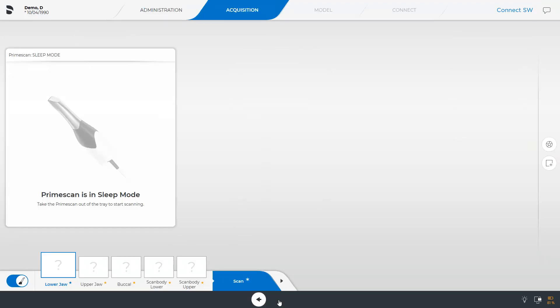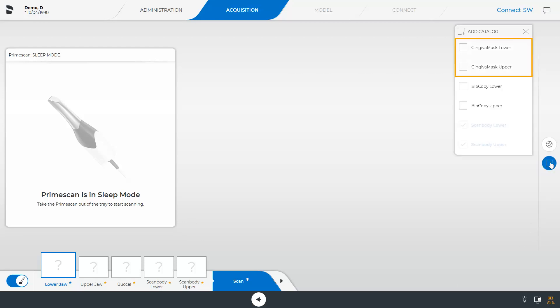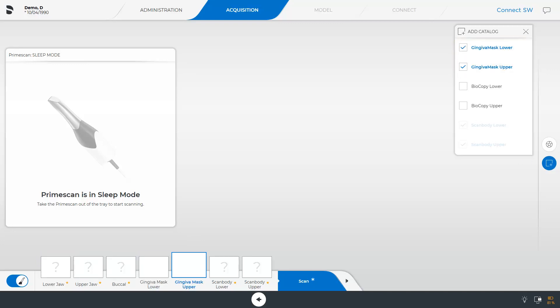For this workflow, five image catalogs are automatically displayed. These are mandatory catalogs. In our case, we will add two further catalogs. From the page palette, we open the Add Catalog function and enable the options Gingiva Mask Lower and Upper.